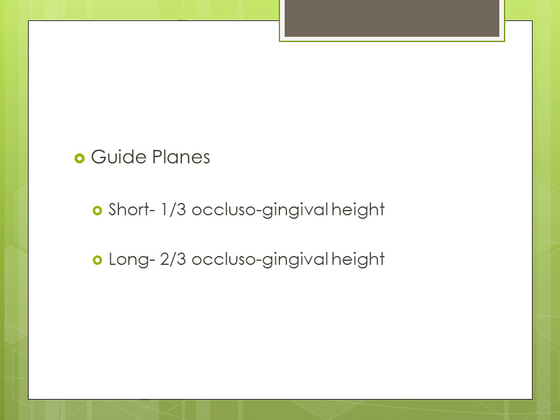Normally, guide planes are short on teeth adjacent to an extension base area, and long when adjacent to a tooth-bound area. Why is that, Dr. Goon? Loading the distal extension base could cause binding of the guide plane and trauma to the tooth. A short proximal plate should produce less potential for binding the tooth when the partial denture is in function. Tooth-bound areas are less likely to produce this effect, thus the proximal plates may be made longer.